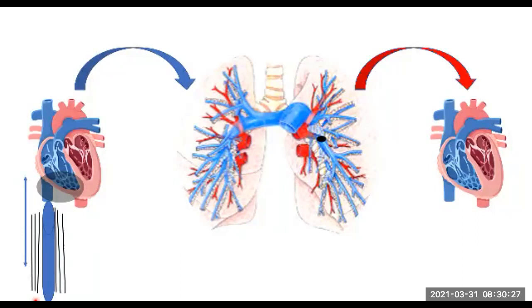So how much blood do you think is getting out over there? Sorry, back on the pointer. Let's close that up, sorry. So we've got this less amount of blood that's getting in there. So how much do you think is getting out? Not much. So what do you expect to happen to your patient's blood pressure? Okay, it will start to decrease, all right. So your patient's blood pressure decreases with the ventricle that's becoming smaller, okay, and unable to push as hard.